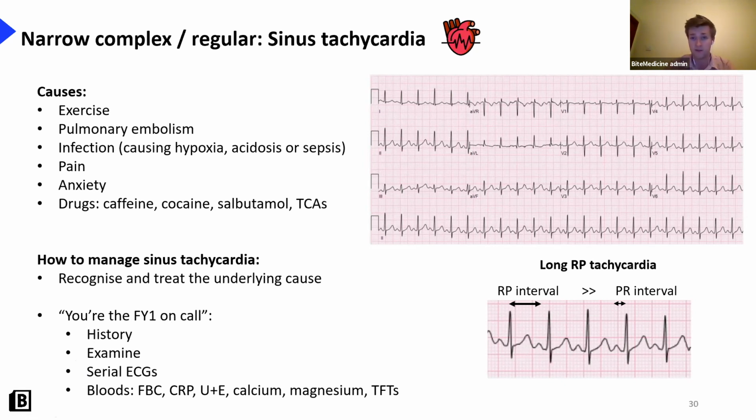But all I'd say is if you've got any concerns about an ECG, there's no shame in getting someone to look at it, because if you're worried, then you might be worried for a valid reason, and you might have ended up spotting something and potentially saving someone's life. So no shame in asking people to check.